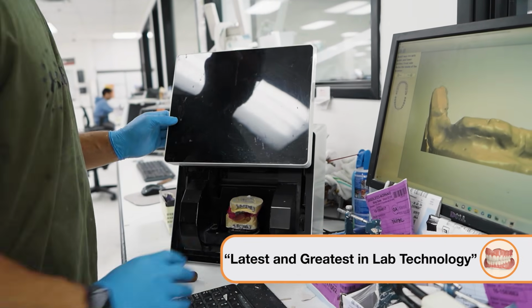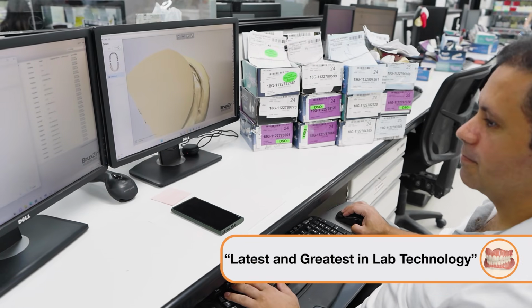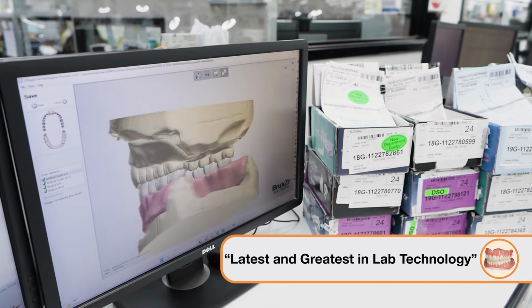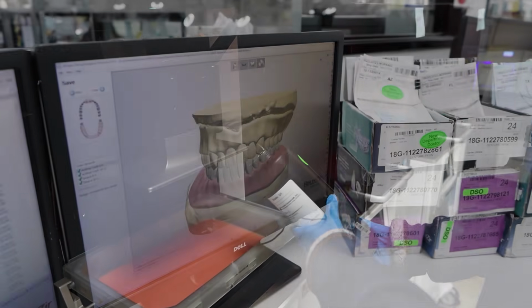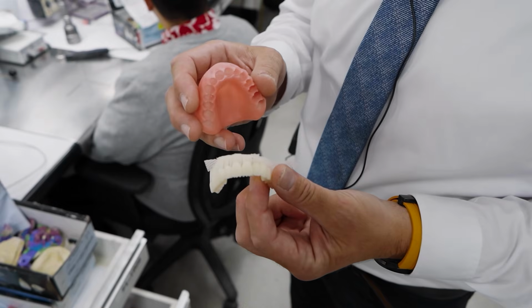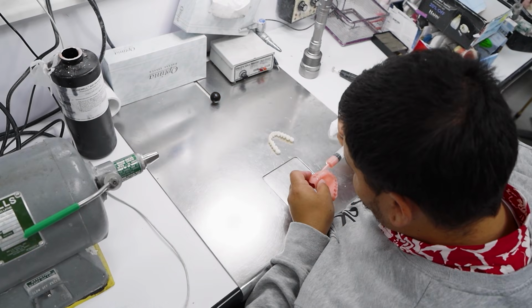Third would be, I want to make sure the lab has all the current technology. Example would be a digital denture workflow, having the proper software, equipment, all the 3D printing equipment, and the expertise that go with that would be important.